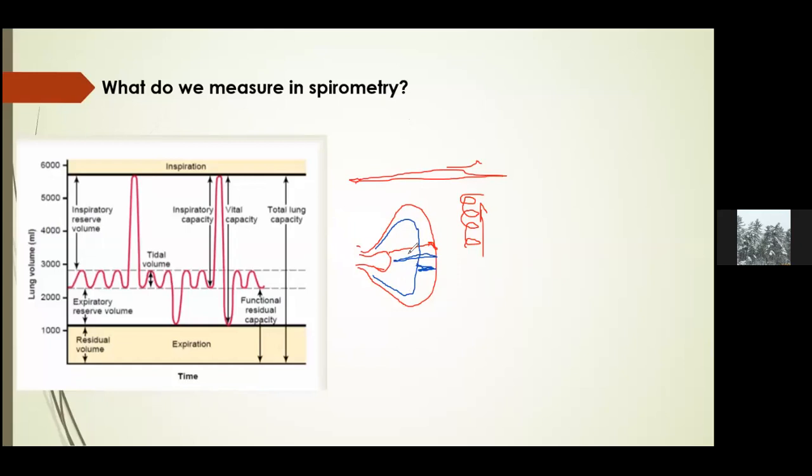So this is another thing that you normally test when you're looking for those lung conditions. So for example, like we said, when you have emphysema, you tear down the walls and you find that these lungs, even after exhalation, do not go back to their normal size. And we'll see the graphs that are represented in such conditions.